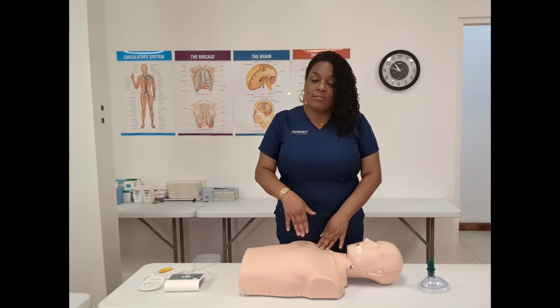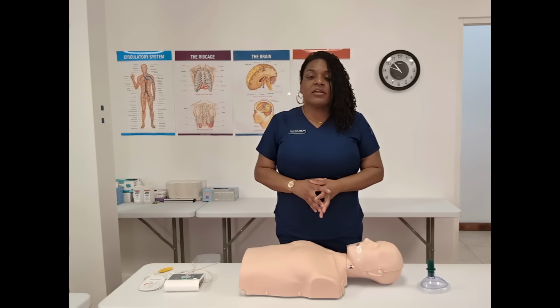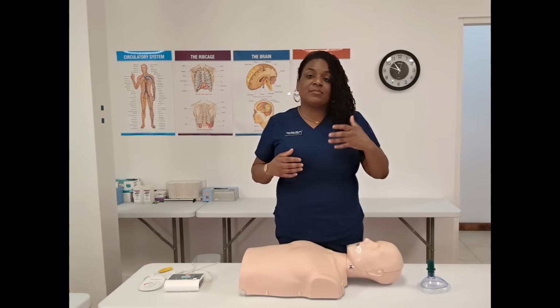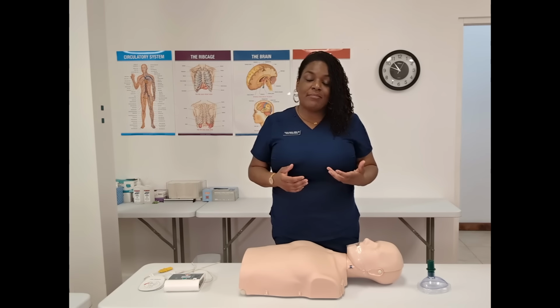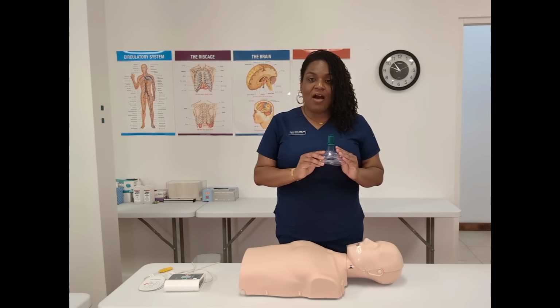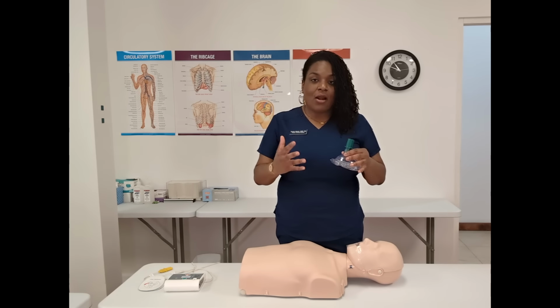If you think about 10 years ago, the American Heart Association came out with guidelines which said that you can just do hands-only CPR, which means that you wouldn't have to put your mouth on the victim's mouth. Whenever the advanced professionals arrive, they're usually going to come with equipment and then they can take over the breaths. But for our purposes today, I do have a pocket mask with a one-way valve, and we're going to use this to simulate our breaths.